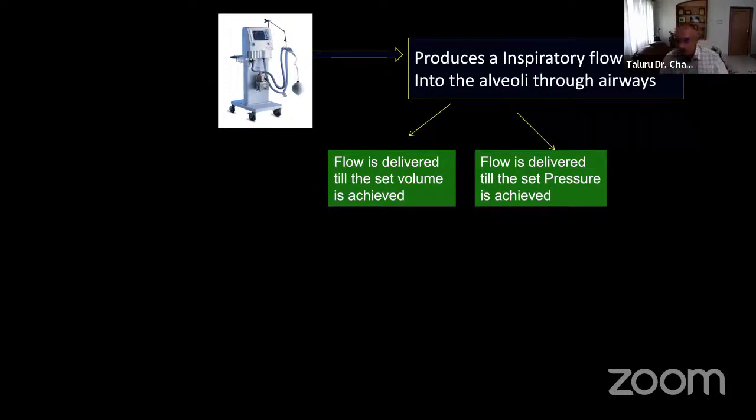So if you think that volume support is a very new mode, it is not a new mode. It is a pressure support based mode, where the ventilator has a technology where it analyzes the tidal volume, and we have given a range of pressure support. So newer modes are not very different. It is very, very simple to understand. I'll try to make you see 1 or 2 modes so that you understand. Once you understand the basic physiology, how these 3 modes work, you can go back and analyze all the modes.